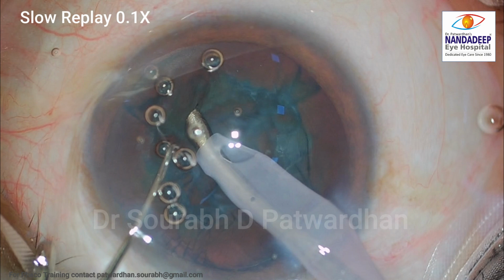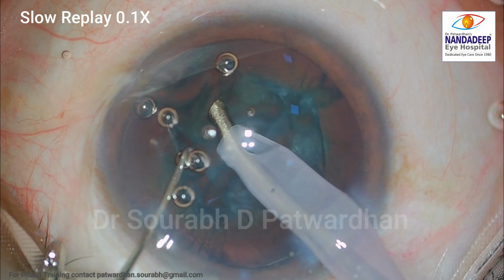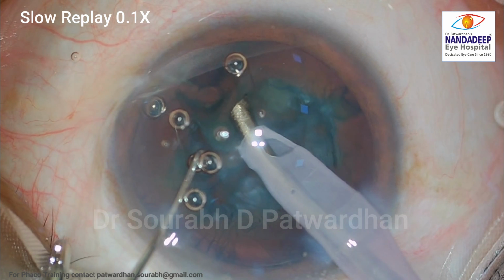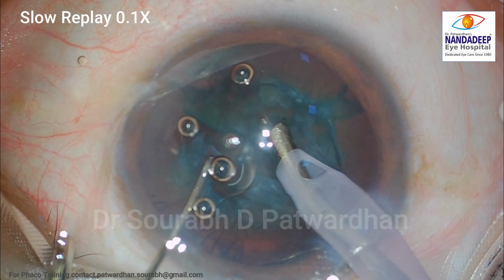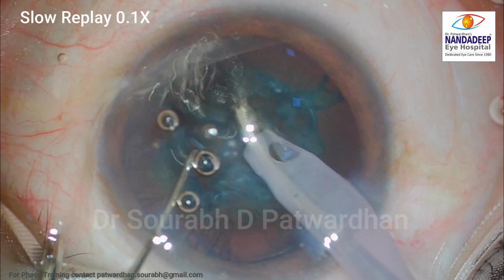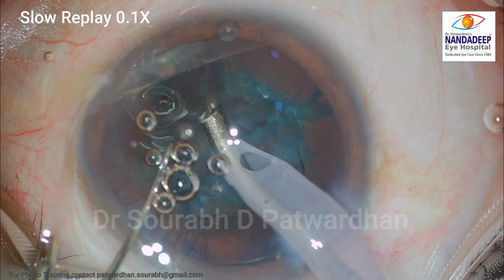So I think though the phaco tip oscillations may be a small cause for production of these bubbles, the major part of these air bubbles are coming directly from the irrigation, and that is something we should be aware of, and it is something our assistant should watch for when the machine is being primed.